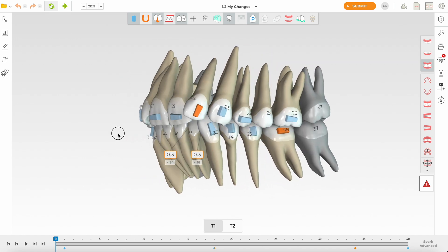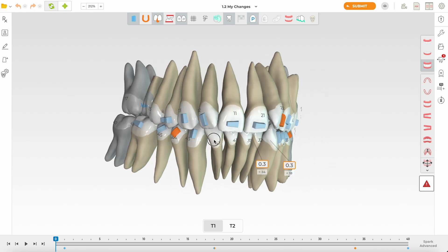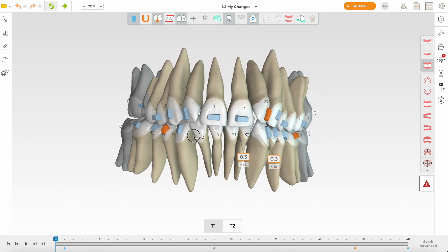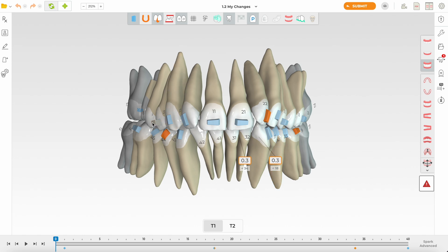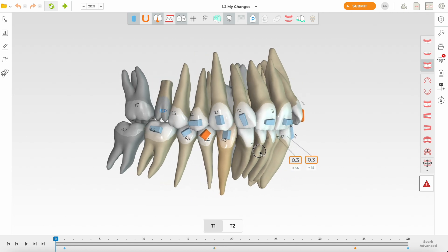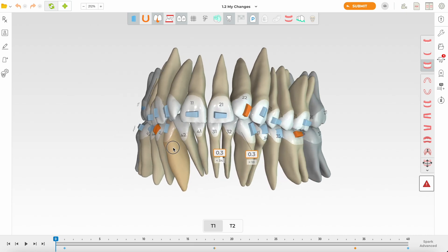This is a great case for somebody who's at an intermediate level in aligners. There's also a bit of a midline shift — we can do some asymmetric IPR to correct that, and possibly gain space from expansion and incisor proclination. Not a difficult case. I'm going to show you how I plan this.